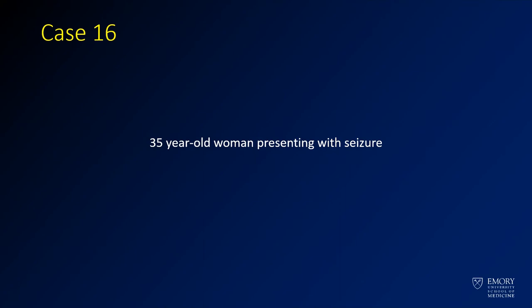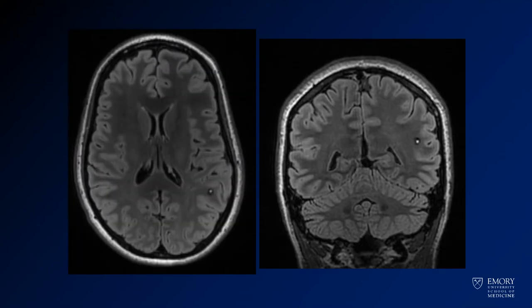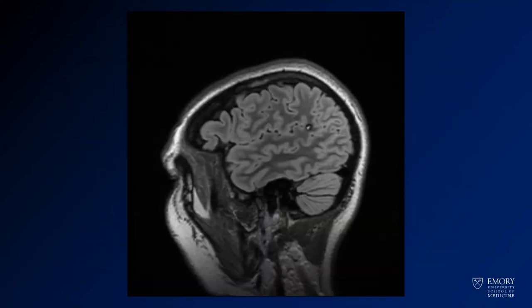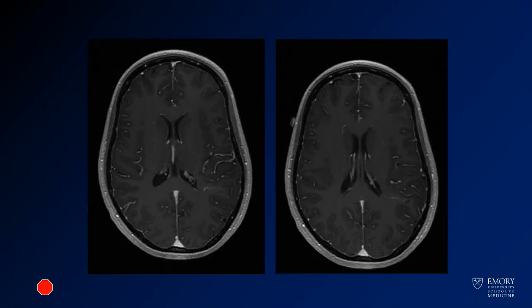Case 16 is a 35-year-old woman presenting with a seizure. Here we have some FLAIR images from an MRI, including a sagittal FLAIR, and finally some post-contrast images through the same level.